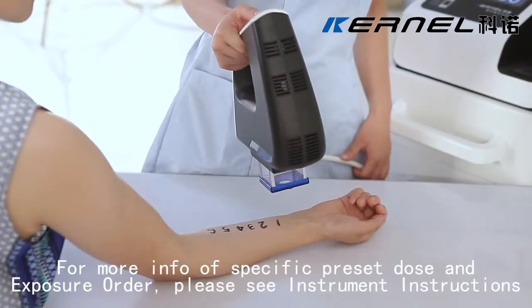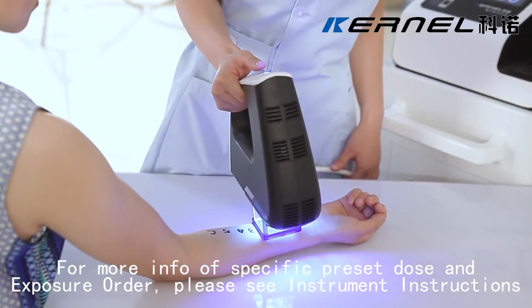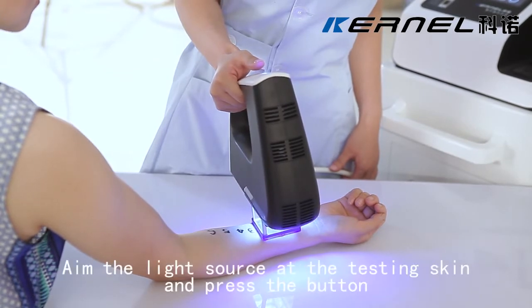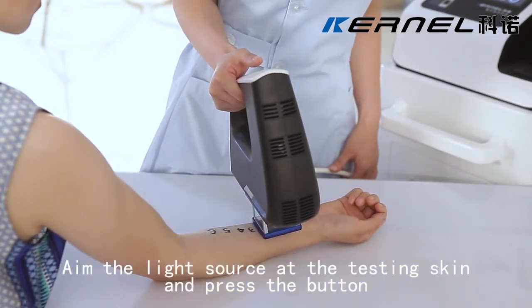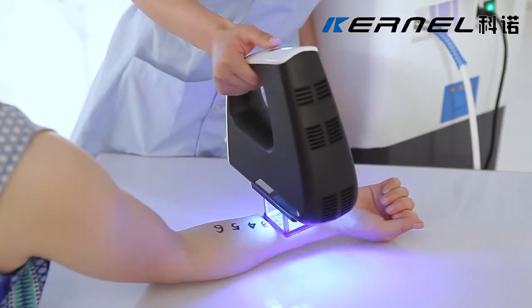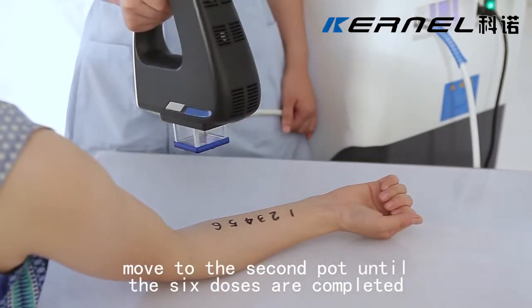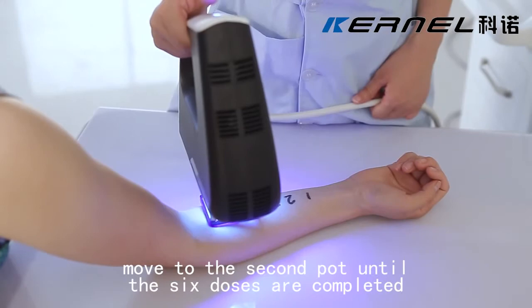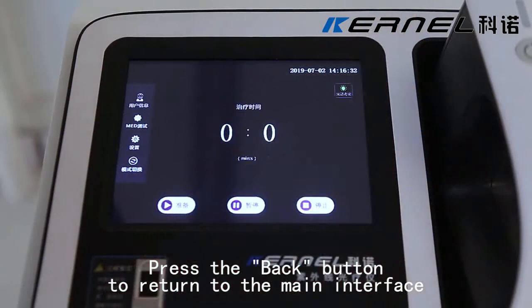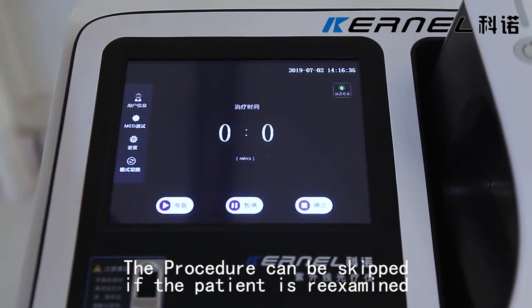For more information on specific preset dose and exposure order, please see the instrument instructions. Aim the light source at the testing skin and press the button. After the first dose of irradiation is completed, move to the second spot until all 6 doses are completed. Press the back button to return to the main interface. This procedure can be skipped if the patient is re-examined.